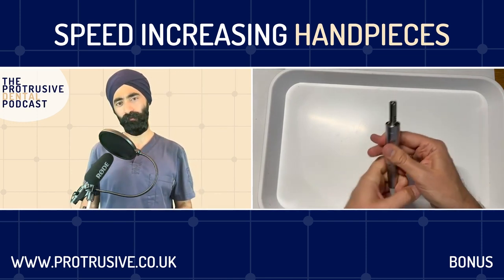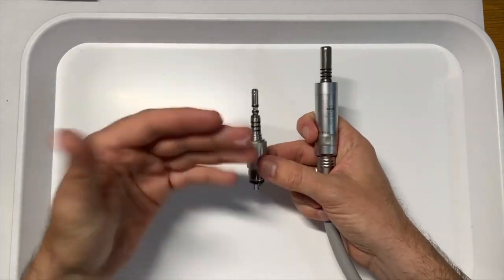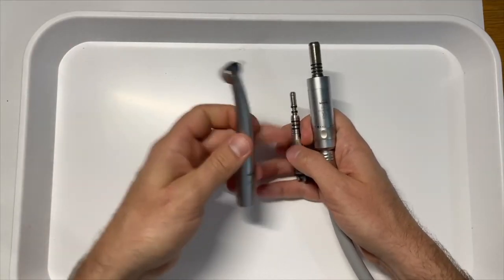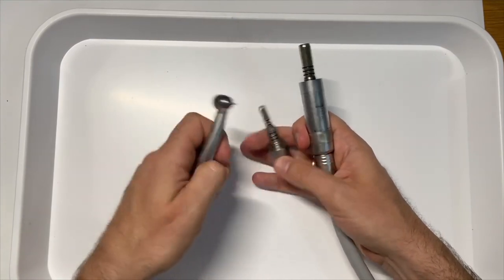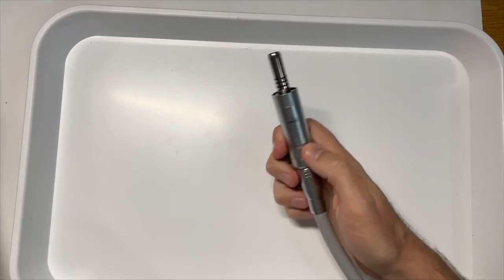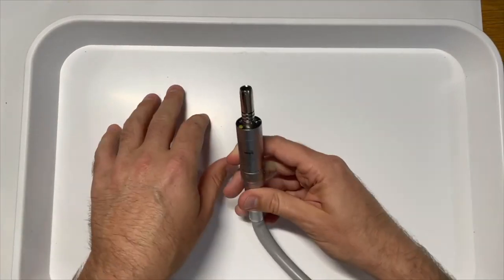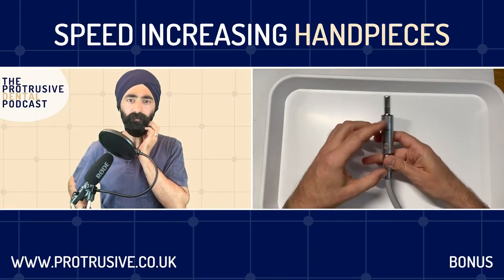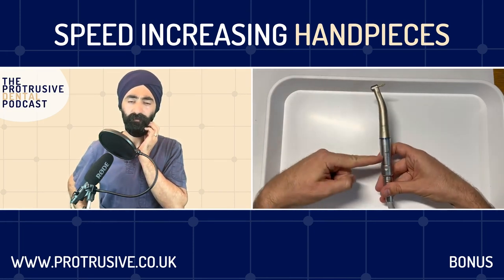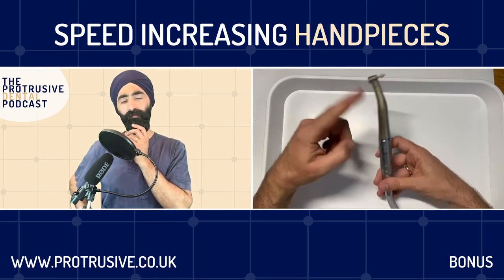The next main type is an air motor - the air turns the motor and then the motor turns the handpiece. We're used to these because we use them for all our slow-speed handpieces. These have a universal standard connection. They go at an absolute maximum of 20,000 RPM. On a slow speed at one-to-one ratio, if the unit runs at 20,000, the slow speed runs at 20,000.